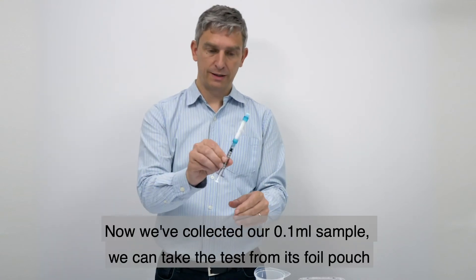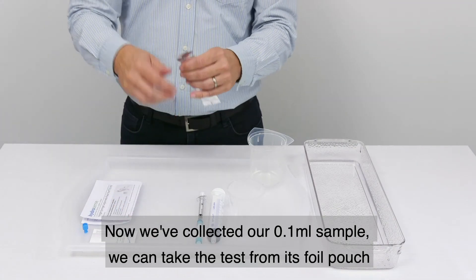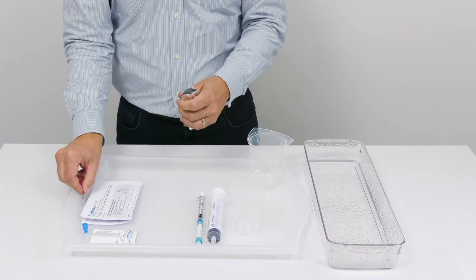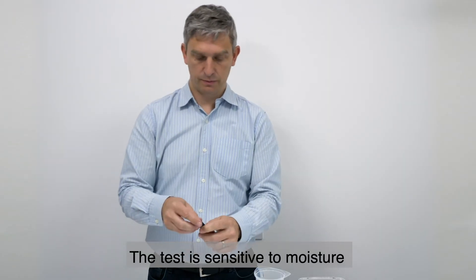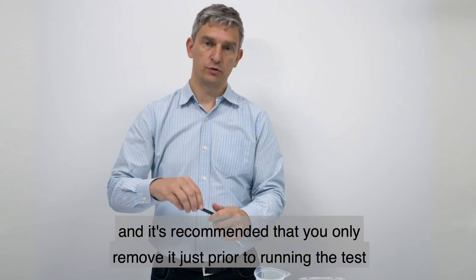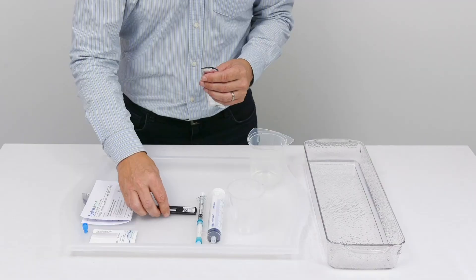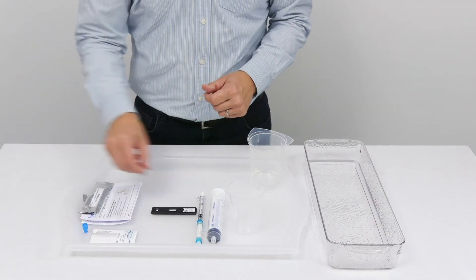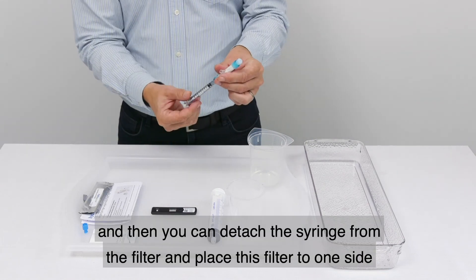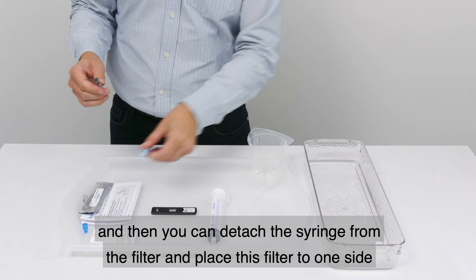Now that we've collected our 0.1 millilitre sample, we can take the test from its foil pouch. We do this just prior to running the test, as the test is sensitive to moisture and it's recommended you only remove it just prior to running. Place the test on a flat surface, then detach the syringe from the filter and place the filter to one side.